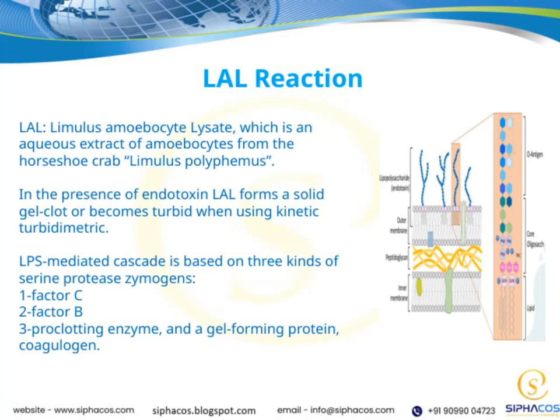Let's take a closer look at LAL, which stands for Limulus amoebocyte lysate. This is essentially an aqueous extract derived from amoebocytes of the horseshoe crab, specifically Limulus polyphemus. It's a fascinating biological reagent because it reacts specifically to endotoxins, such as lipopolysaccharides or LPS.